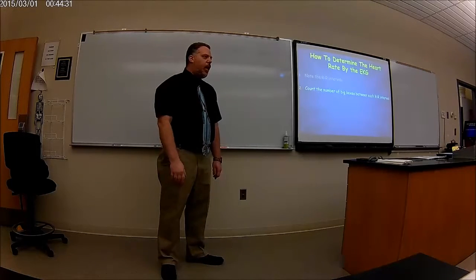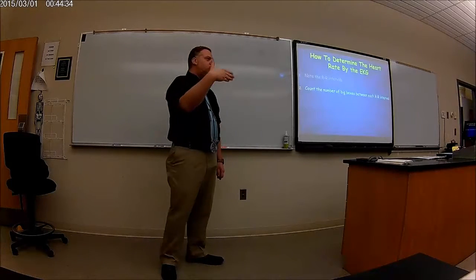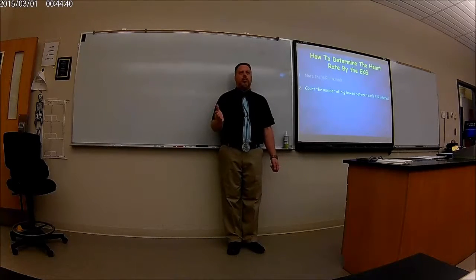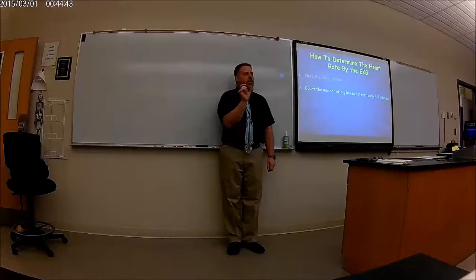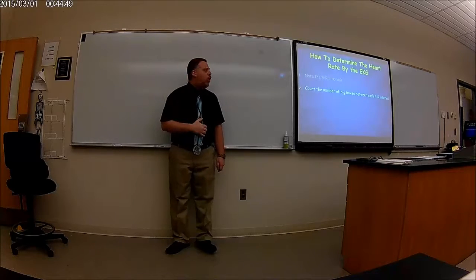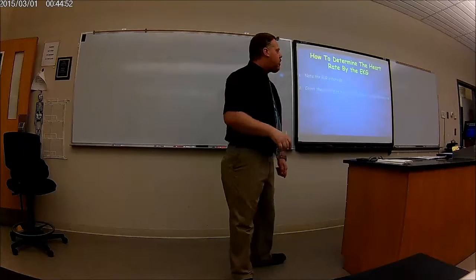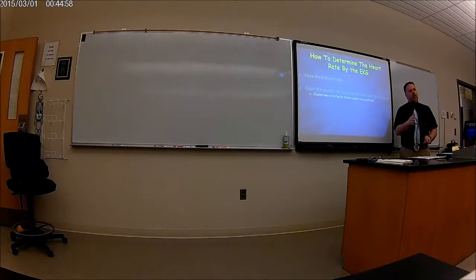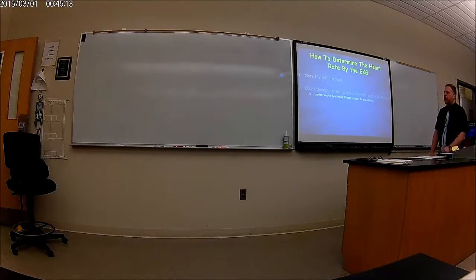Please, the big boxes. Don't count the little boxes. When it goes on the practical exam, people are saying that there's like 150. It's not 150. It's only like 3. You know what I'm saying? And then you're going to get the wrong answer. It's the number of big boxes, not the number of small boxes in between the RR intervals. That's the easiest way you can find the R, or where you're going to count them: see if there's an R that's right on the solid, bold, thick line of the box. I'll show you what I mean by that. It's easiest to find it that way.